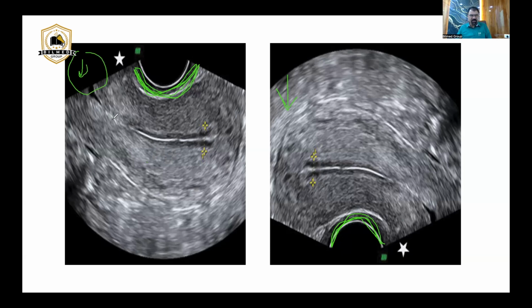What you see on the screen first is the cervix and the vagina, and the fundus is placed posteriorly. In the other orientation, you will see the fundus first, and posteriorly the cervix and the vaginal stripe. So there is no difference in the image quality, only the anatomical positions on the screen are inverted.